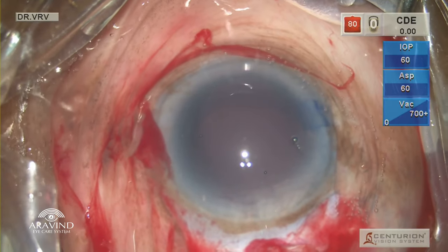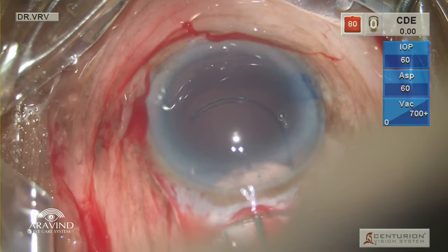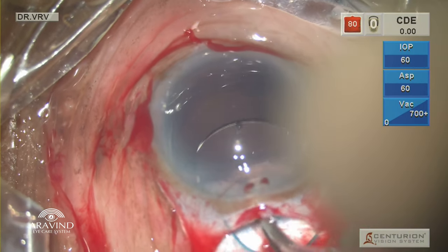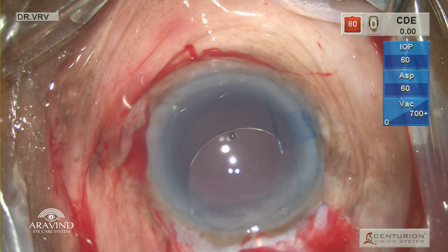A three-piece intraocular lens is chosen for this patient. No particular reason, you can also place a single-piece intraocular lens. The optic is held at one-third of the position, tilted downwards so that the leading haptic goes into the bag. Viscoelastic is again filled into the anterior chamber.